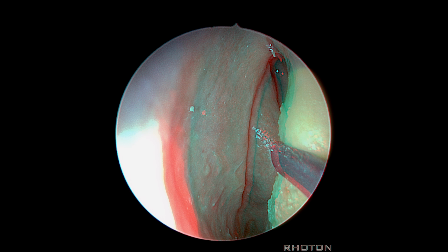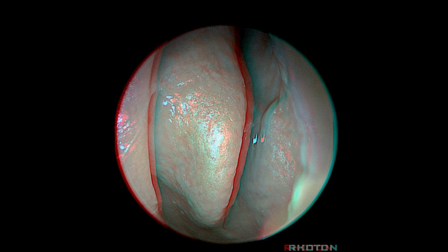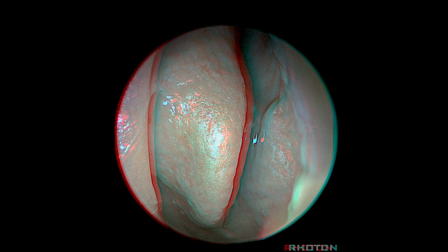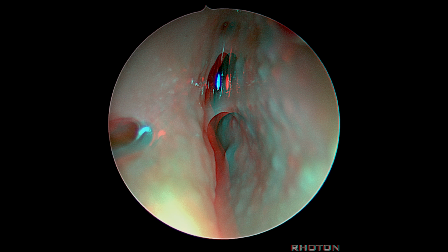Here's the turbinate. We're looking in the middle meatus under the turbinate. So here's the middle turbinate. Here's the uncinate process of bone. And then back of it, you begin to see the bulla. And here when we retract that turbinate, these are anterior ethmoidal air cells. And to get to the anterior fossa, you have to work through those, so that here we're down in that sulcus behind the uncinate, the air cell, and we get into that area behind the uncinate process.